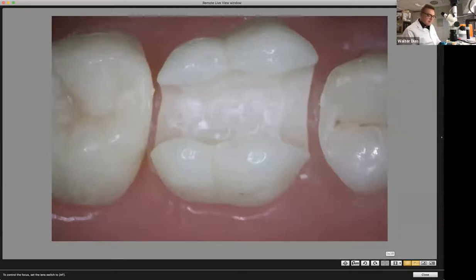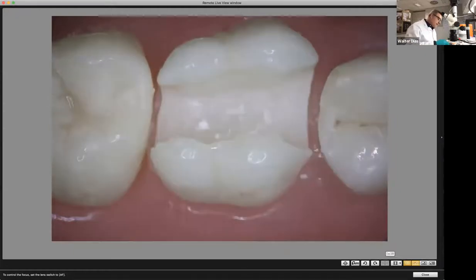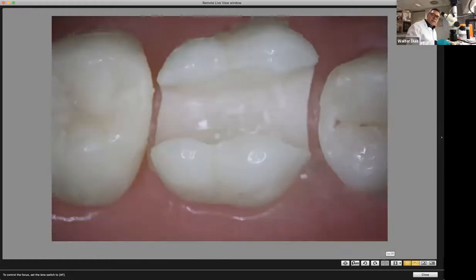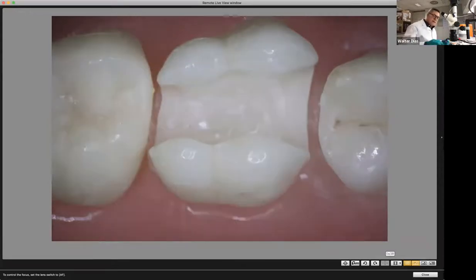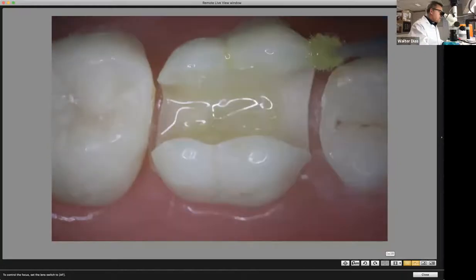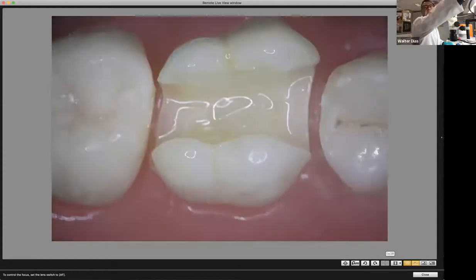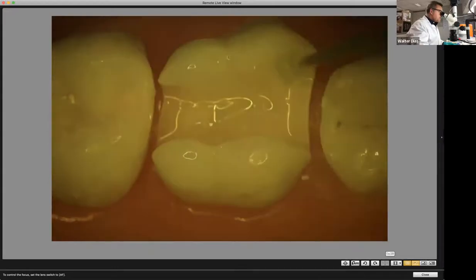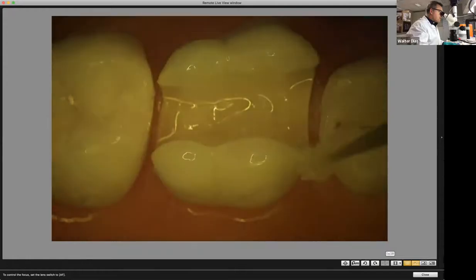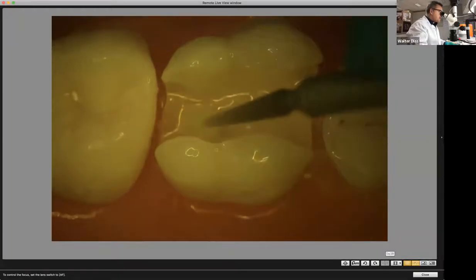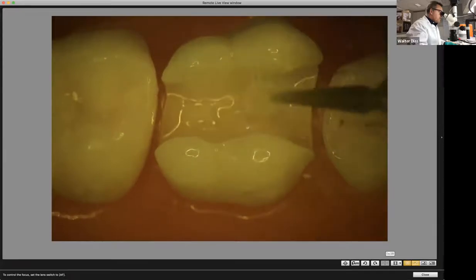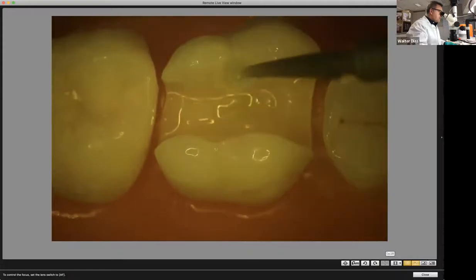Generally, I dry around the area, then remove all the excess water from the tooth without desiccating too much. Then we apply the adhesive in the center and spread it all around the margins. Always go beyond the preparation, at least one to two millimeters. Now we need to massage the dentin and respect those 20 seconds. I applied with a little excess of adhesive, but we should avoid pulling. We're going to remove the excess of adhesive with the same microbrush after drying it a little bit.